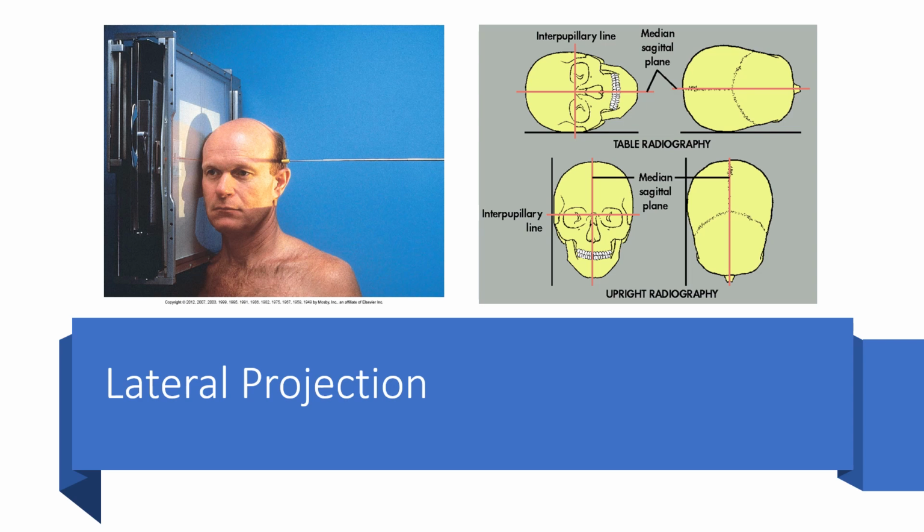Okay. Now, this patient doesn't have hair. That's very handy. Your patients are going to have hair, so you're going to have to kind of use your x-ray vision to see the border of their scalp and figure out whether that's included within your light field. Barrettes, bobby pins, hairpins, all that kind of stuff is going to have to be removed for the radiograph, and you will probably make some middle-aged women very upset when you tell them that they have to remove all that stuff.